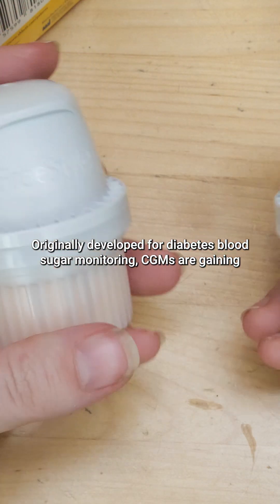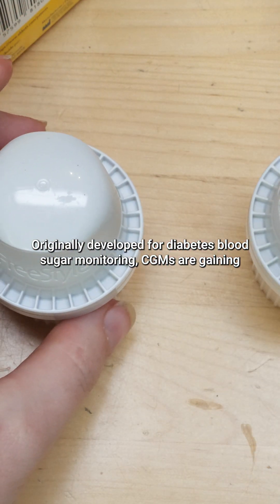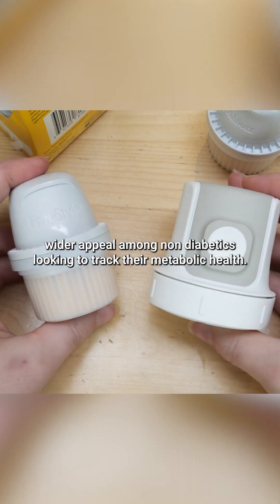Originally developed for diabetes blood sugar monitoring, CGMs are gaining wider appeal among non-diabetics looking to track their metabolic health.